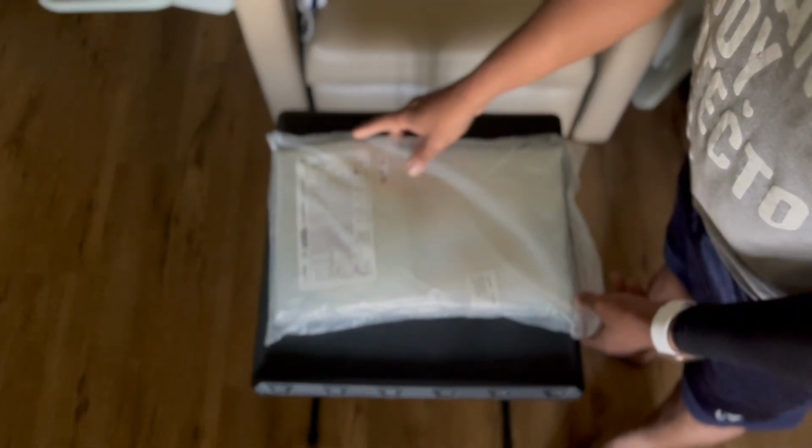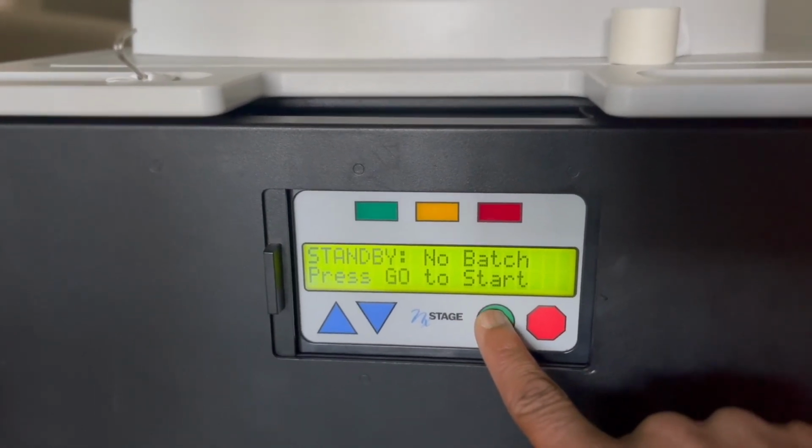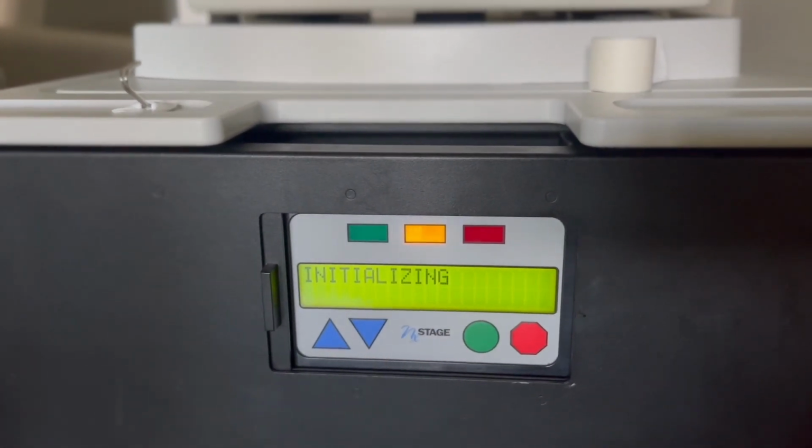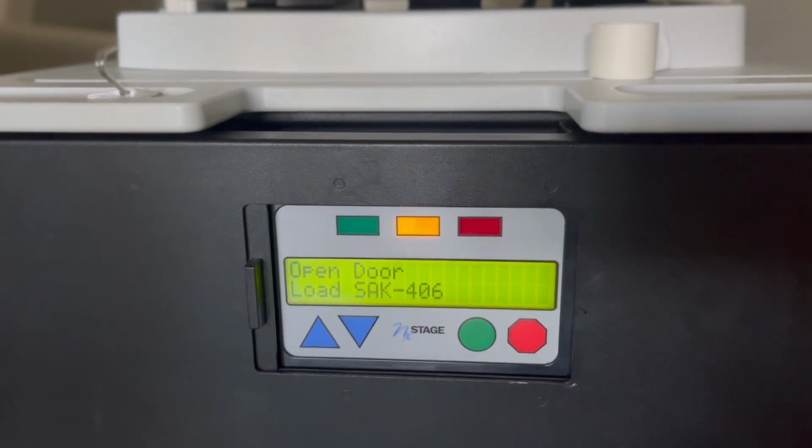What I'm going to do first is undo the bag here. Now I'm sorry that it's kind of blurry, but I didn't want you to see my prescription, right? So you're always going to check the prescription, and you're always going to check the date on the bag before you use it, just for safety measures and just to make sure it's good. It's always a smart thing to do, right? So the next thing is we're going to press the green button for go, and it's going to start the process. As you see, you're going to hear 3 loud clicks.